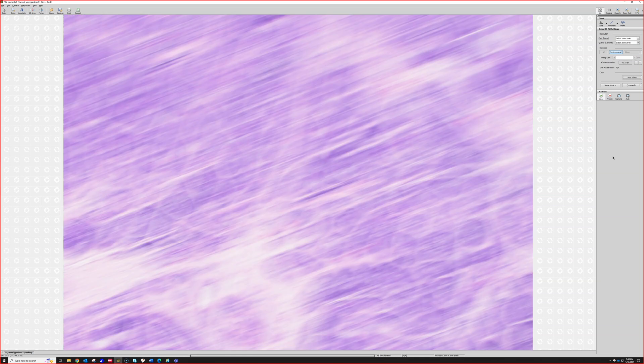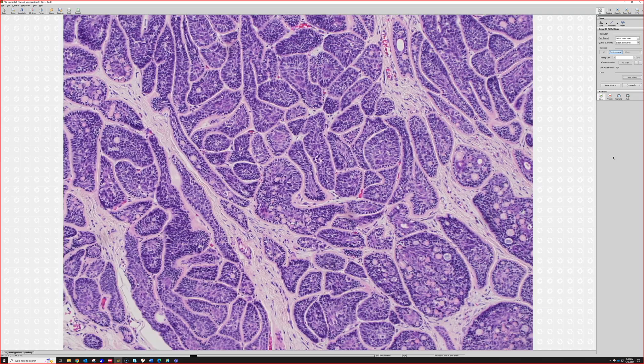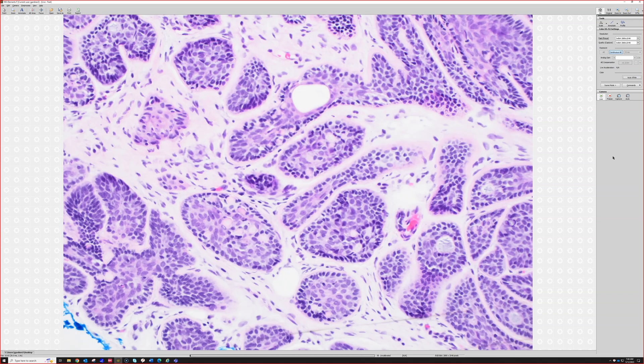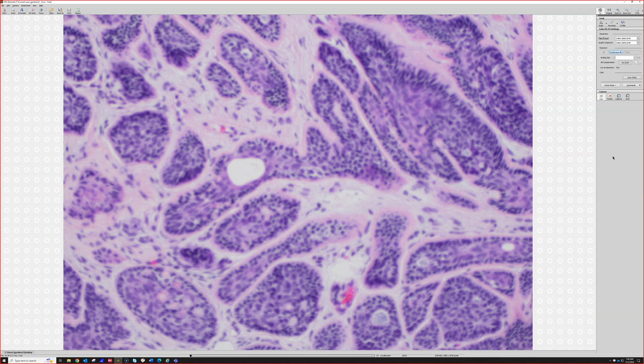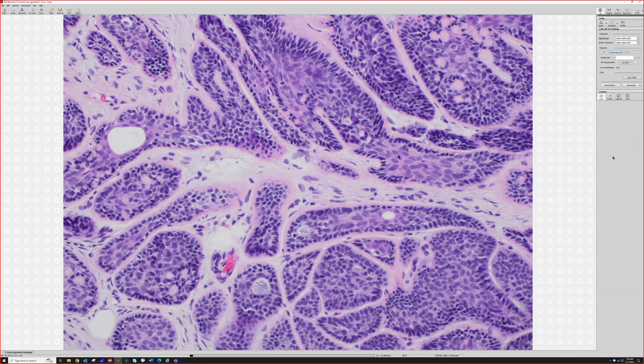Don't be surprised if you find some areas that look like spiradenoma in the tumor, because that's often present. And then you'll see a variable amount of sweat ducts — here's a sweat duct right here. But honestly, this is such a recognizable tumor. Once you know what it is, you don't even need to go looking for the ducts; you see it from low power and you know — cylindroma.